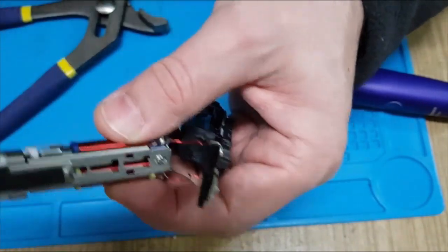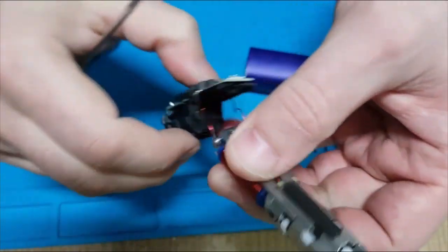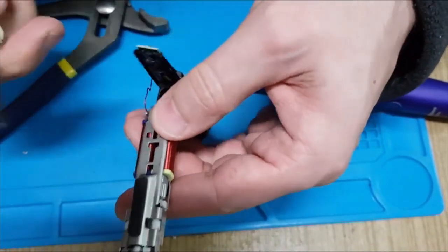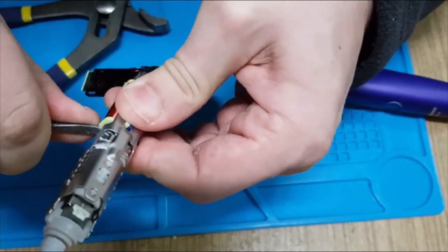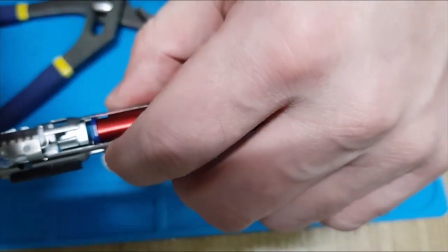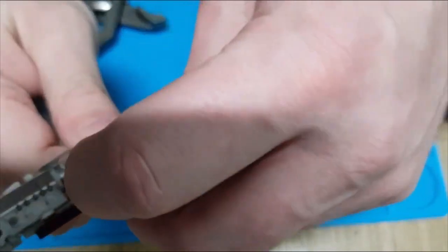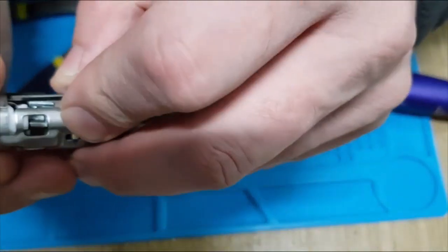And you have two screws. So you need to loosen the screws. What I found, this one was quite loose. What I found is the best solution is to insert a simple screwdriver and make some space, then insert a simple piece of thicker plastic. It should be something around 0.5 millimeter, because the smaller the gap, the better the vibrations.